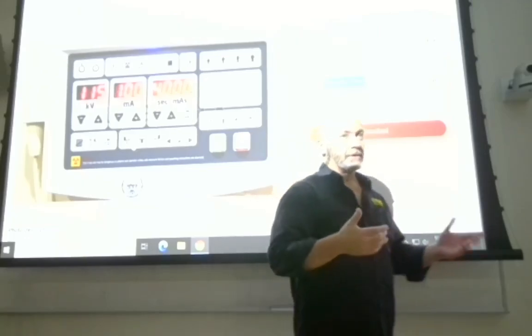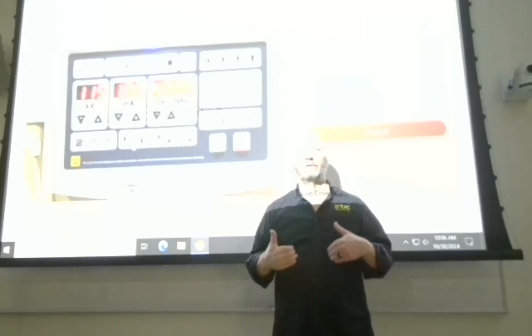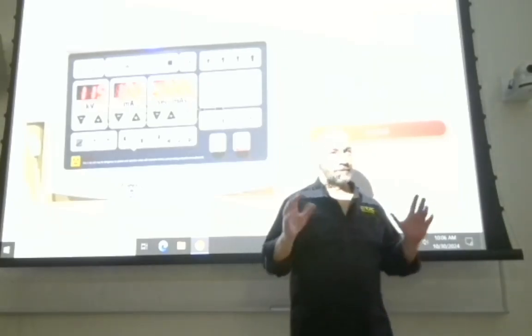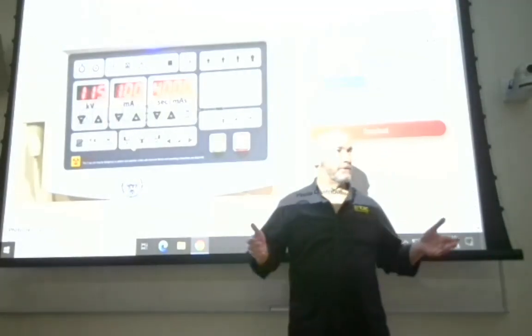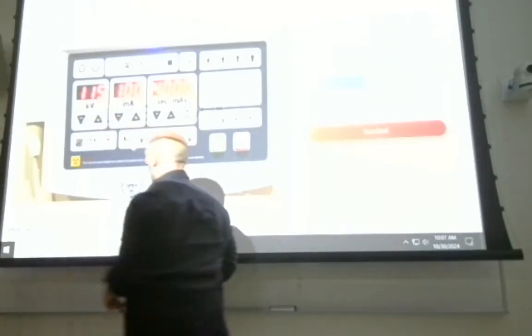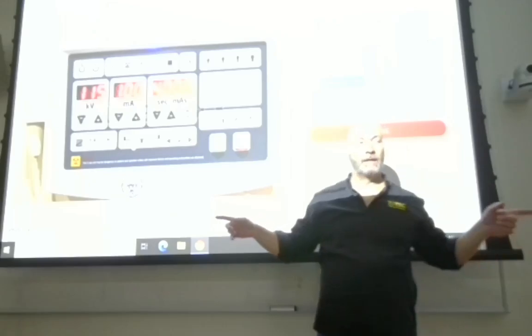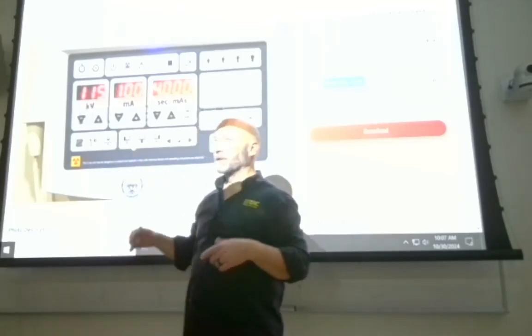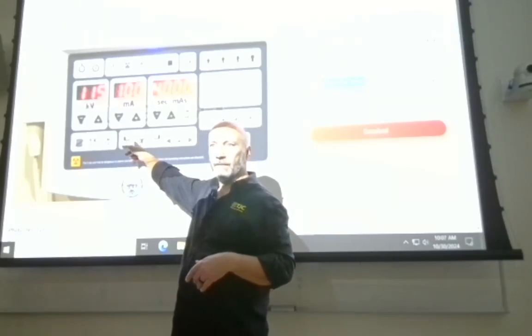I know we hadn't started into L spines yet, but if we're only interested in seeing the L spine, what should you do? Should you shoot just like a KUB? Well, in some cases, yes, and we'll talk about that as well. But according to the textbook, no, you shouldn't. You should collimate in, right? So where are these on your wall bucky? They're way outside, right? So your automatic exposure control, your photocell configuration for an AP of the L spine should just be that one right there.